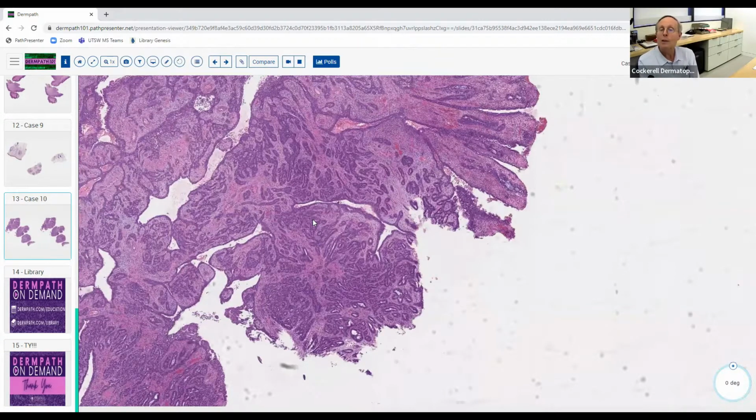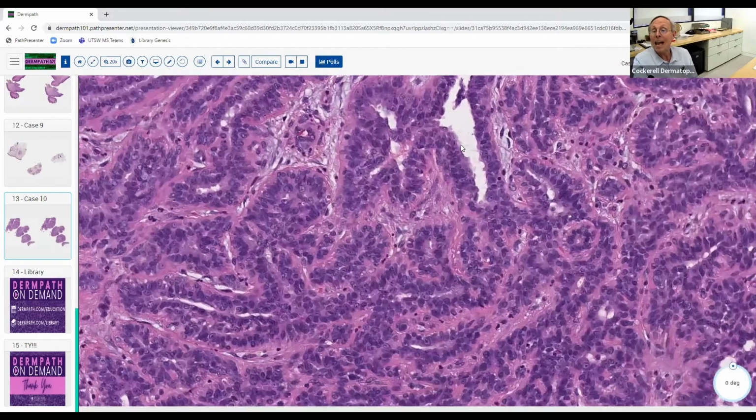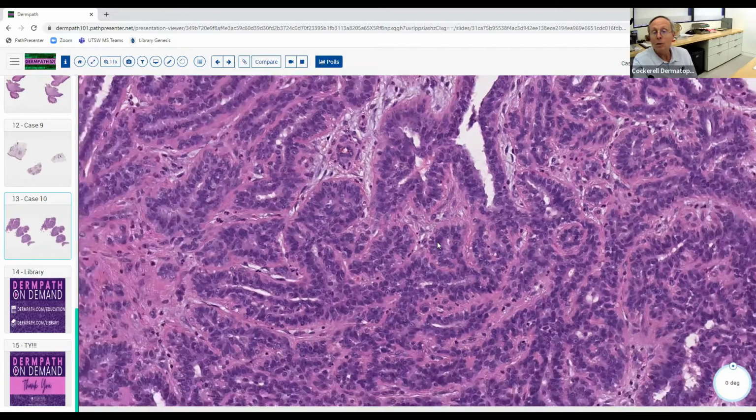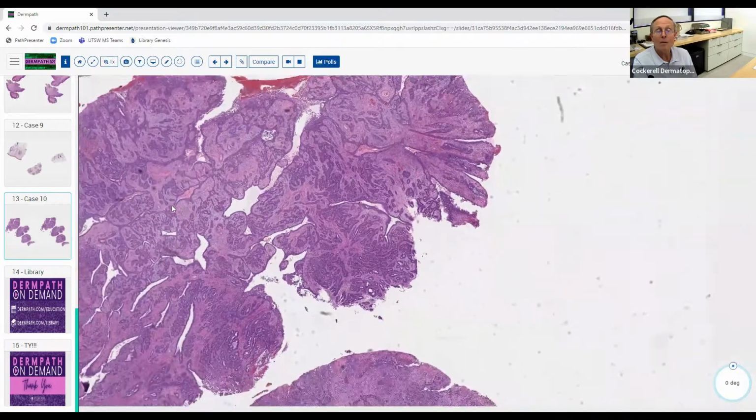Very close to syringocystadenoma papilliferum, only this lesion is located in the groin area, often the vulvar area of women. It looks like a little cyst or a little eroded nodule, as opposed to syringocystadenoma papilliferum, which is more of a plaque-like lesion on the scalp that's often associated with nevus sebaceous. So this is hidradenoma papilliferum. Another benign adnexal neoplasm, with nice apocrine differentiation. You can really see that here very beautifully. It's a totally benign process, just another one of the cutaneous adnexal neoplasms.